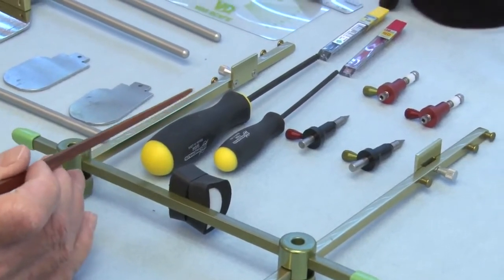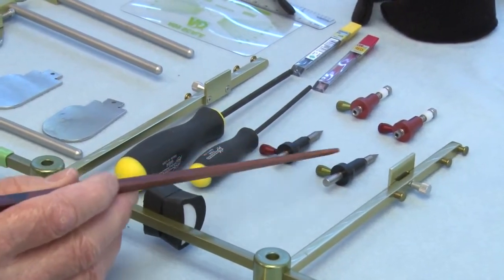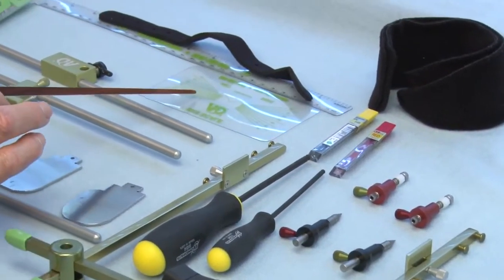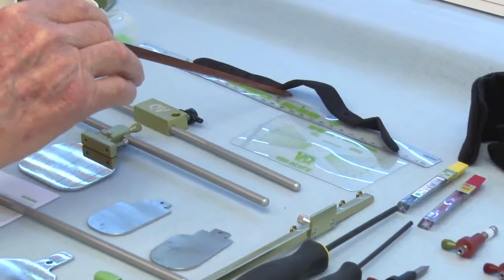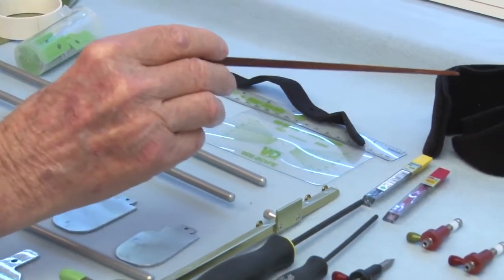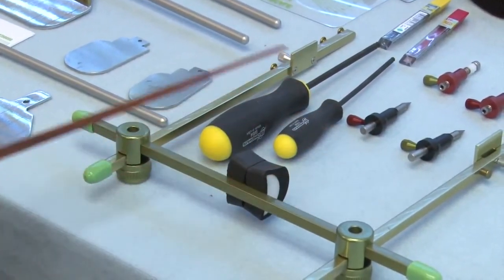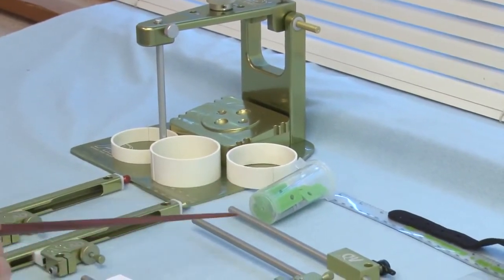and then we have the large and small hex wrenches. We have stylus pins, right and left stylus pins, and we have the writing pencils with a red lead and black lead. We have a graph here which allows you to measure the angle of the eminence, and a ruler to measure the millimeters, an elastic strap, and a Velcro system that supports the hinge axis flag assembly on the patient. And then we have discluders, and you'll see how these discluders work.